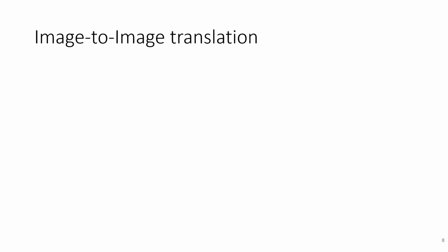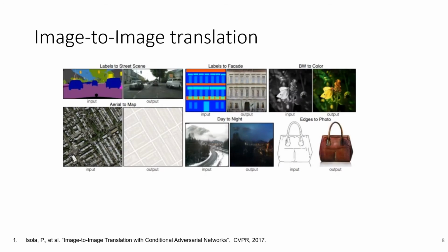Through this slide, we introduce the popular and well-established image-to-image translation network, that is Pix2Pix, which is also our baseline method. Now, Pix2Pix is a conditional GAN consisting of a generator and a discriminator pair, where the generator is tasked with generating realistically looking images, conditional on an input source image.